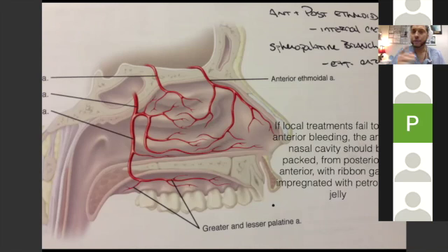And by the way, in the holding area, you want to confirm which side is more open. My right nostril is more open. So that's because it alternates throughout the day, vasoconstricting, vasodilation of which side is more open. So figure out which side is more open, vasoconstrict both sides, but topicalize the side you're going to go after.